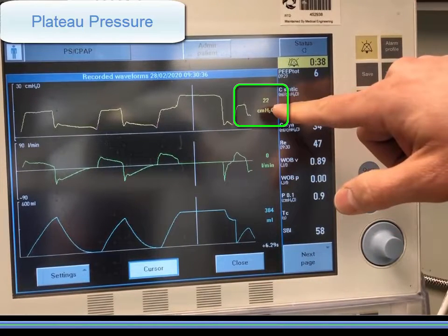A reliable plateau should look stable and flat. Discard any measurements that are too noisy due to active patient interaction, or that show a major leak as indicated by a descending slope.